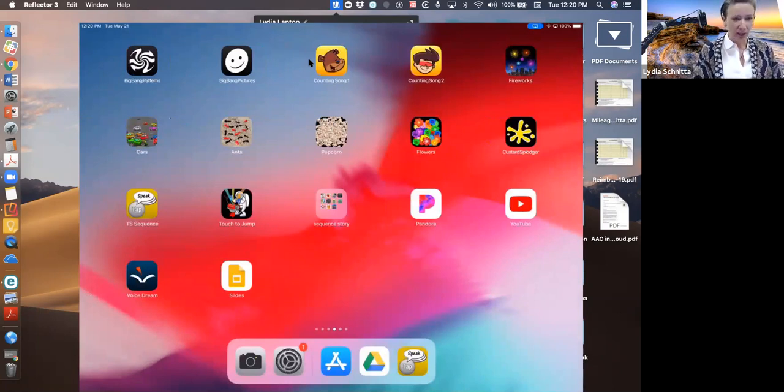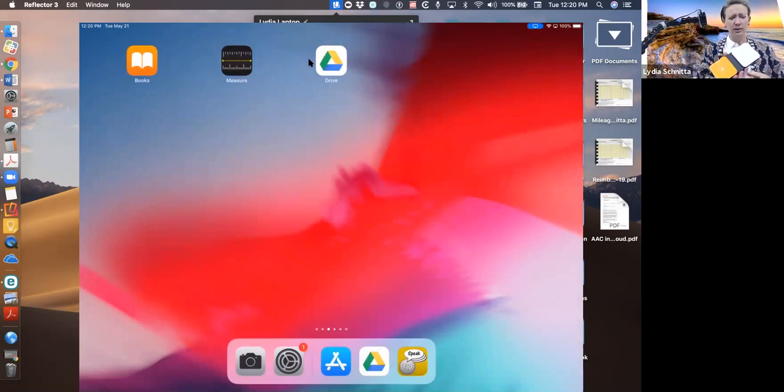So to use an external switch like this one here, I'm going to hook it up to my Bluetooth. I'm going to turn it on, and I'm a little tethered here, so I'm going to take that off, and I'm just going to plug it in on the side into one of those jacks. And I'm going to go to my settings on the iPad. On the left, oh, it's lagging. Sorry, guys.